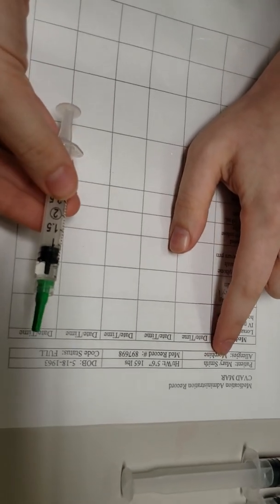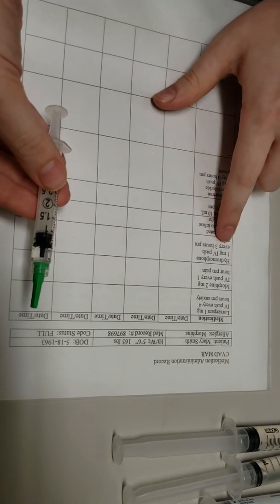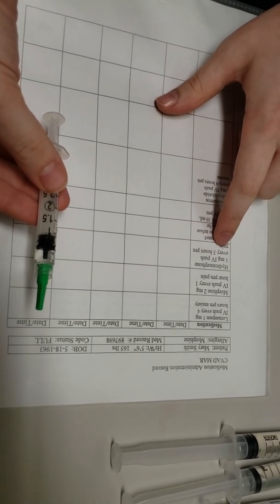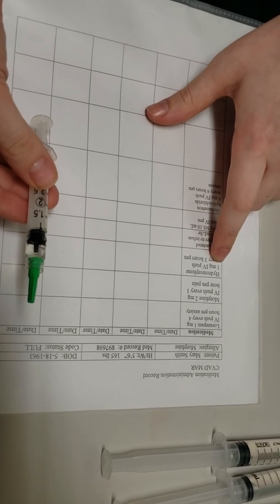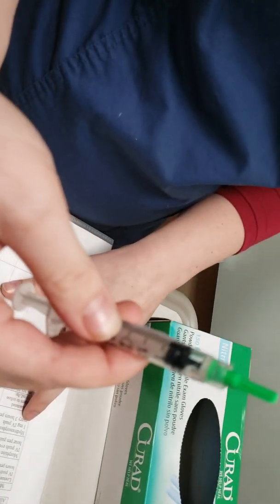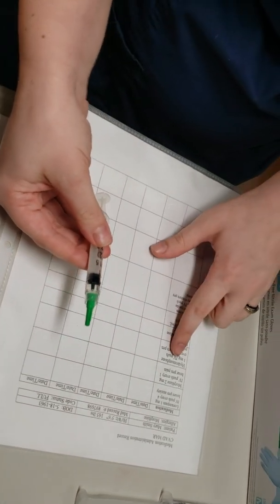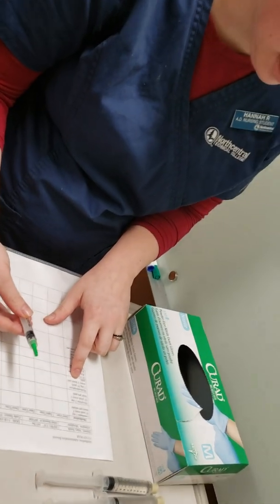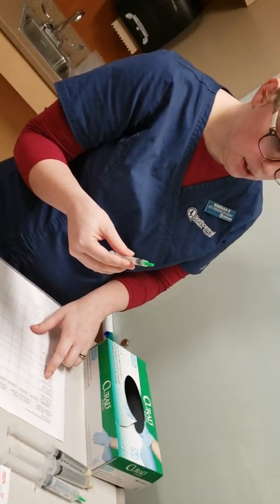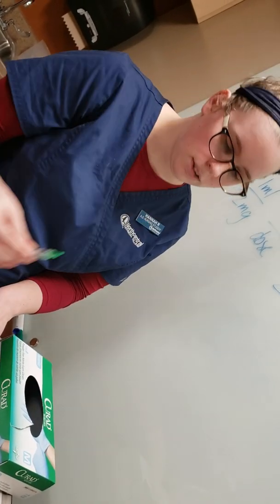So I have a Mary Smith, born 5/18/1963, with an allergy to morphine. I have an order for 1 milligram IV push every 3 hours PRN for pain. 1 milligram of hydromorphone is equal to 0.5 mils. Again, I have Mary Smith, born 5/18/1963, with an order for hydromorphone 1 milligram IV push every 3 hours PRN. 1 milligram of hydromorphone is equal to 0.5 mils, which I have in my syringe.